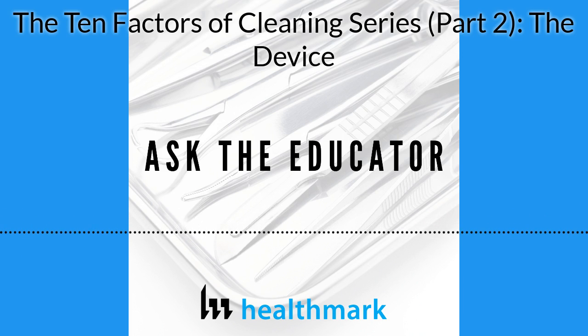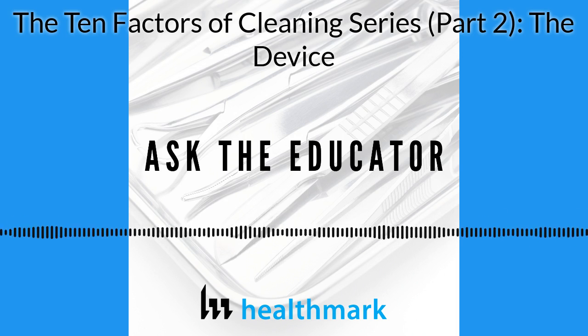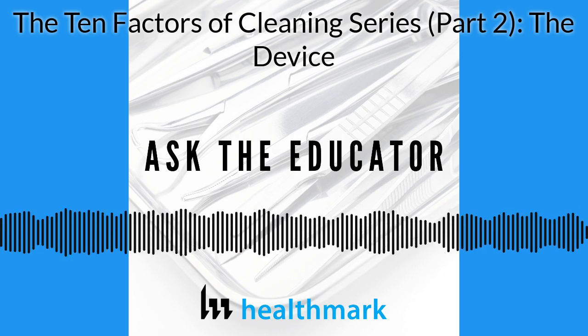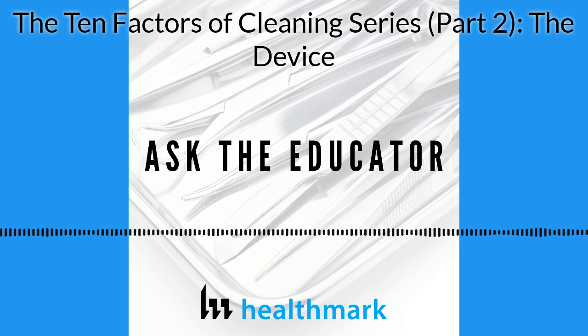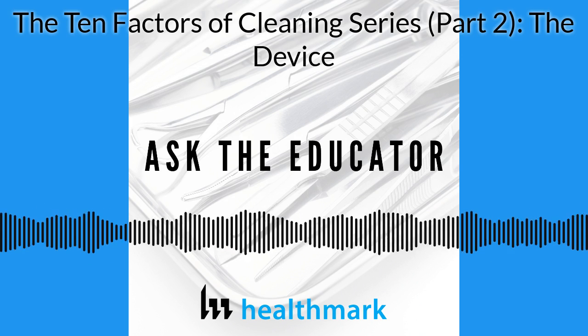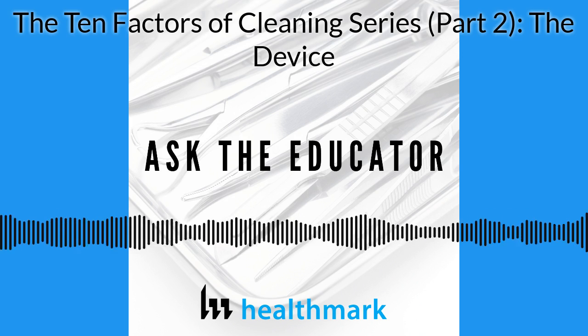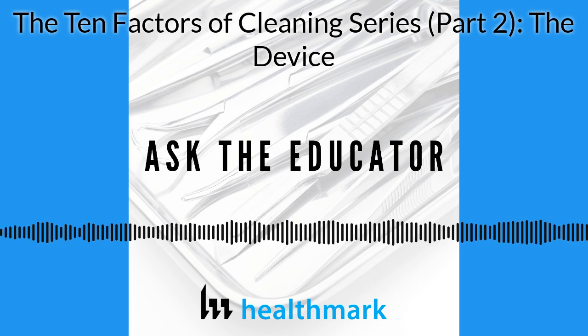Just to recap this episode, Stephen and I talked about another one of the 10 factors of cleaning, which was the device. So what device are you trying to clean? Is it simple, complex, or maybe it's modular? The device design is just one of the 10 factors that play into our cleaning process. And for the manufacturers out there that may be listening, when designing medical devices, we need to keep in mind the need to clean and process for reuse.